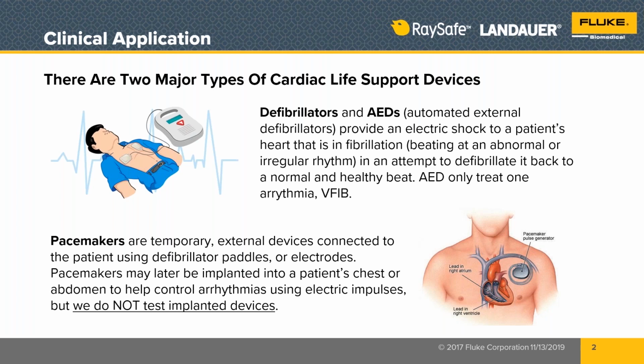And then we have AEDs, automatic external defibrillators, and these you will find in all kinds of places, especially across the United States and in many parts of the world. You'll find them in libraries and other public buildings, schools. We even have them here at Fluke in our hallways just in case someone has a cardiac arrest, because there is a limited amount of time before damage happens to the brain, because blood is not flowing during a cardiac arrest.